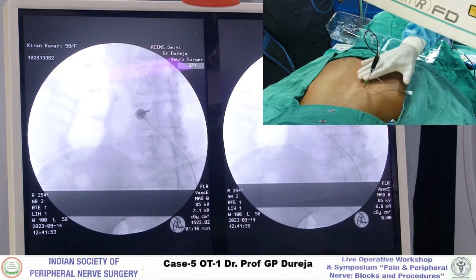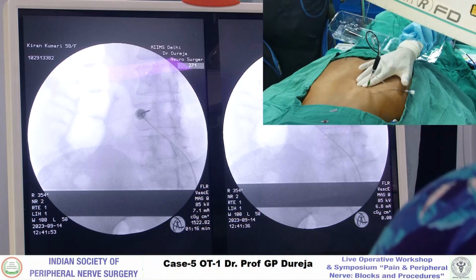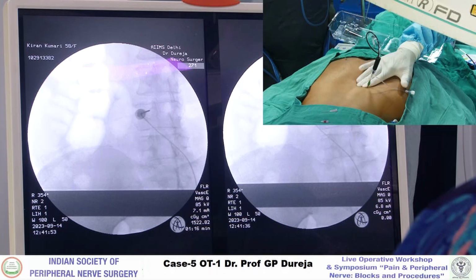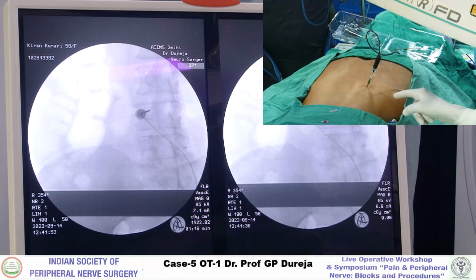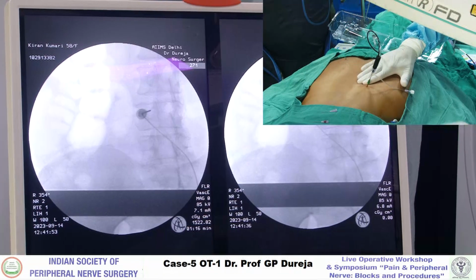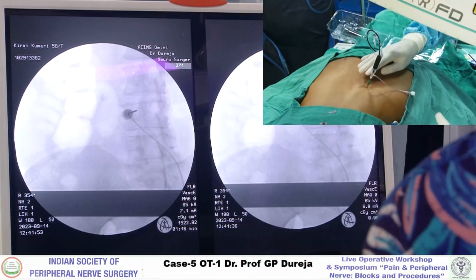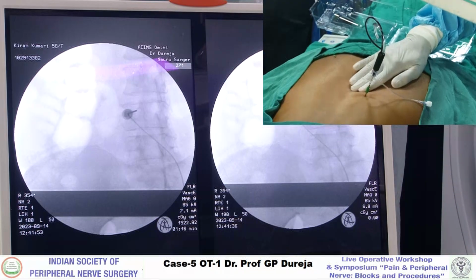Understood. तो मोटर हम बढ़ा रहे हैं. कुछ आ रहा है जी? बढ़ाइए. तो आप इधर फोकस करिए थोड़ा. ये फोकस करिए यहाँ पे. इधर फोकस करो सर, फोन पे बात कर रहे हो. नहीं जूम करो, जूम इन करो. बढ़ाइए.